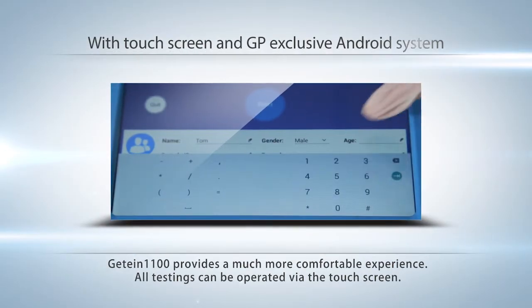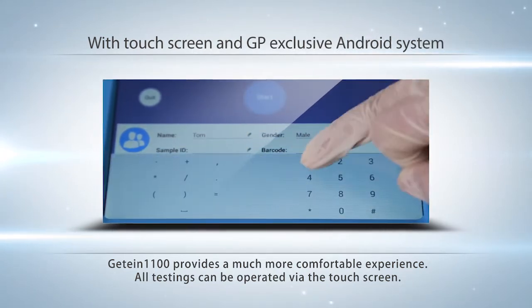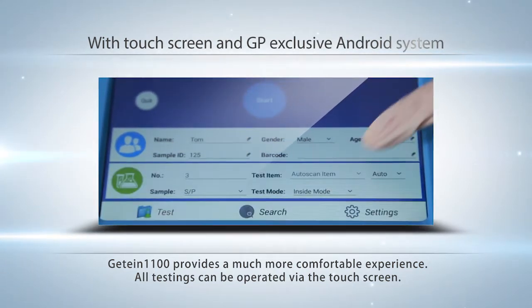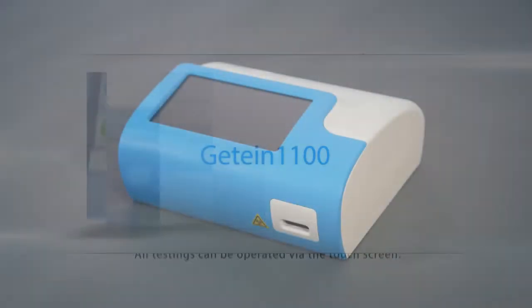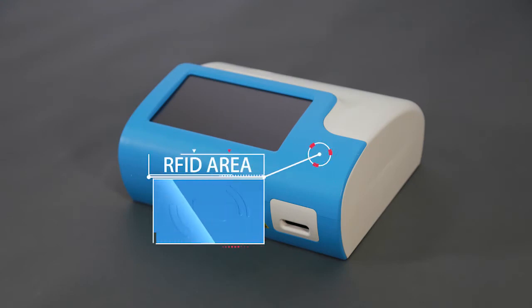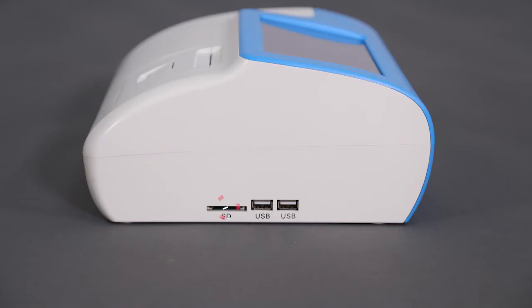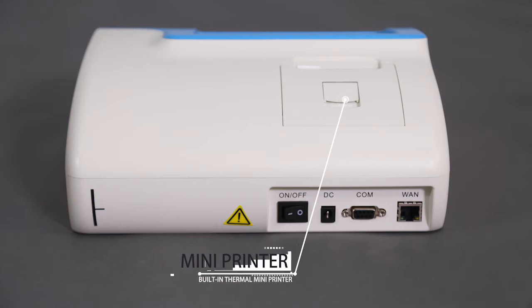With a touchscreen and GP-exclusive Android system, GTIN 1100 provides a much more comfortable experience. All testing can be operated via the touchscreen. On the front of the instrument, we can see a 7-inch touchscreen and a RFID area. On the left side is an SD card slot, used to identify parameter information of the product. There is also a built-in thermal mini printer to print testing results.